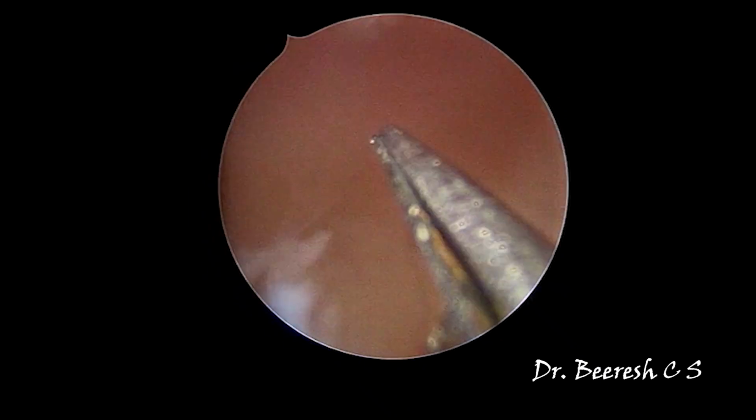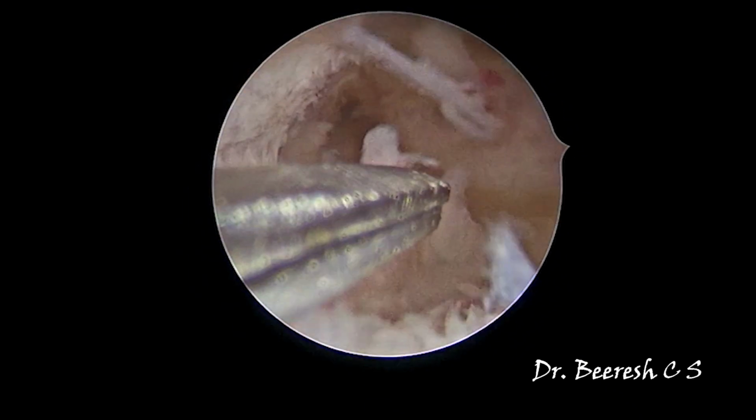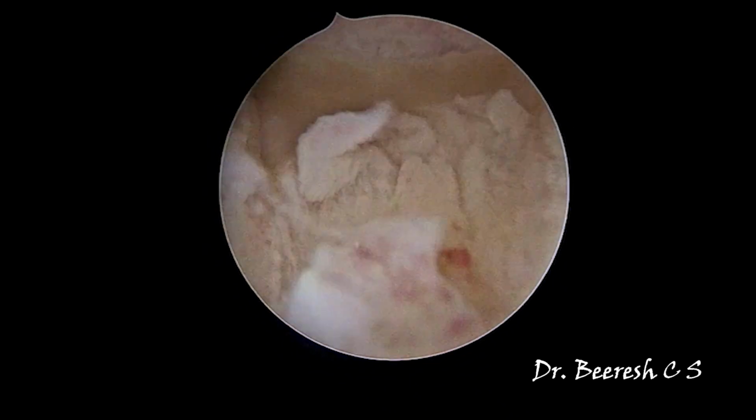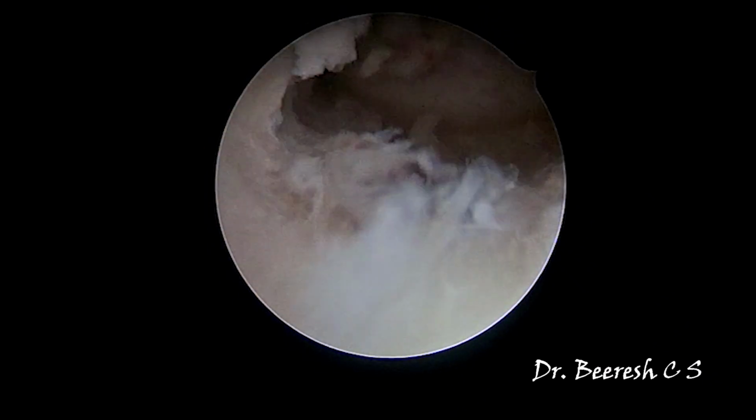Post-operatively, I have inserted a number 8 Foley's with 2 ml of distension to achieve separation of the raw surfaces and to prevent adhesion formation, and have also started estradiol for about a month. So that completes my surgery.